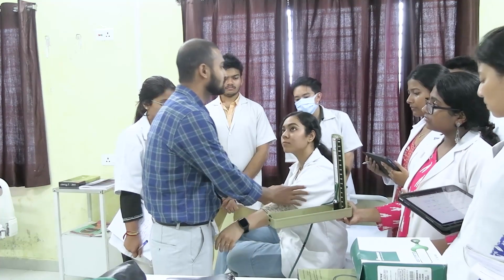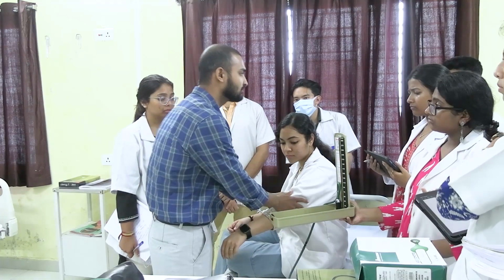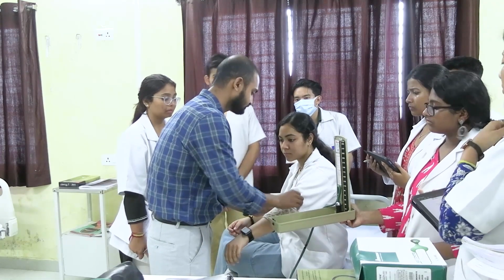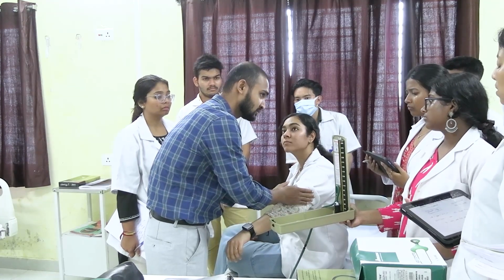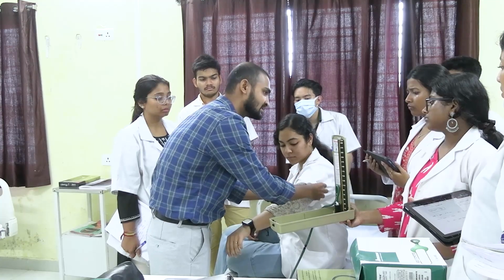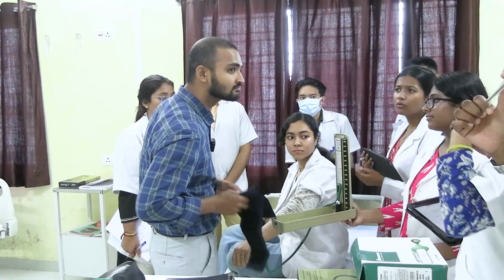First of all, there must be no clothing present between the cuff and the arm or the skin of the patient. And this cloth shouldn't be folded up like this. What will happen? The pressure will be of upper side.